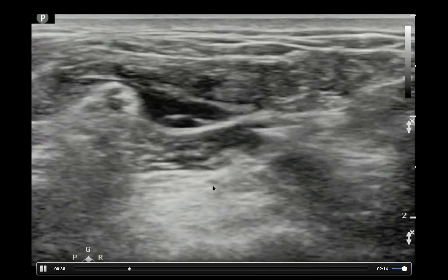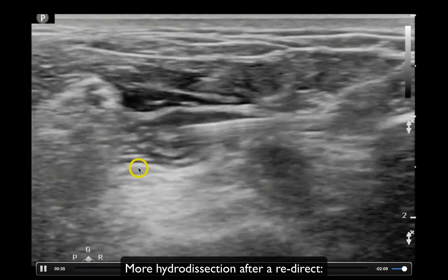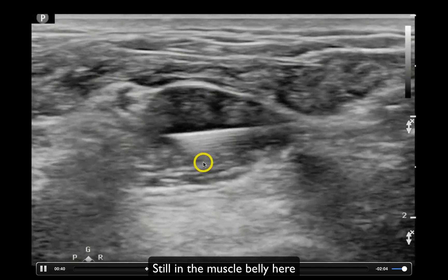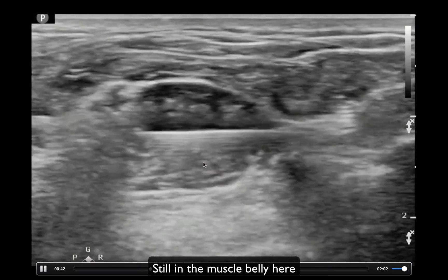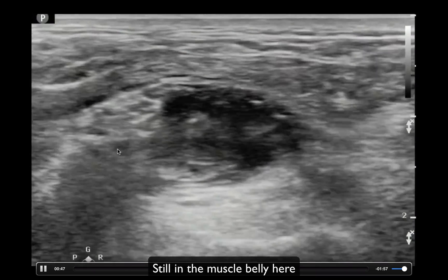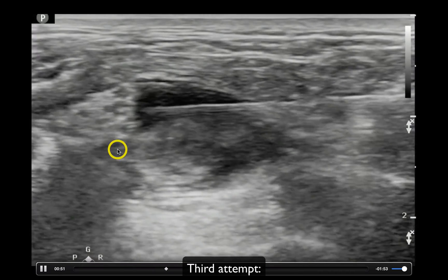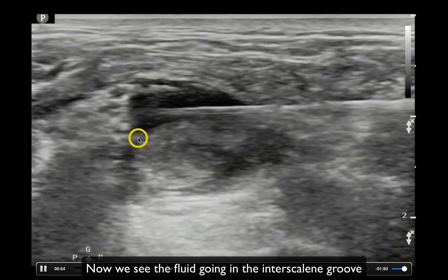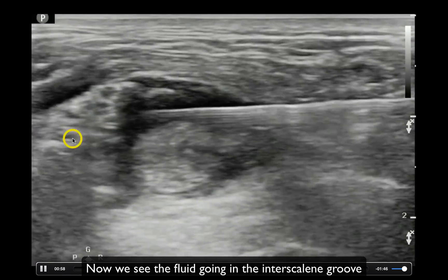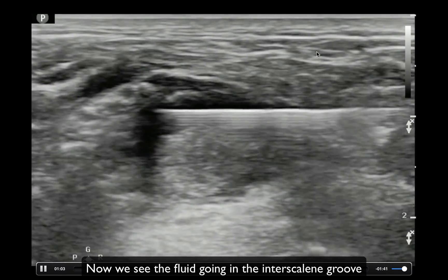Second try with a small aliquot — I can see I'm actually in the middle scalene muscle belly itself, not giving an effective block. That middle scalene is definitely anesthetized, but I'm not seeing the interscalene groove expand the way I want. So I try again — third time's a charm. Right there, you can see the fluid finally getting right into the interscalene groove, and you can see the brachial plexus move away from the middle scalene. That's when you know the anesthetic is in the appropriate area.